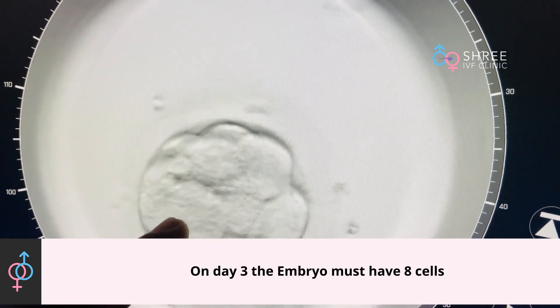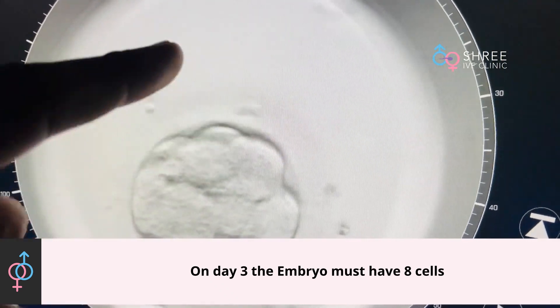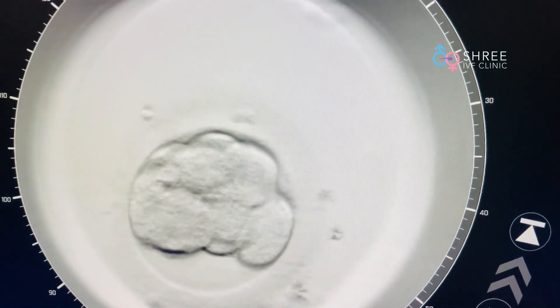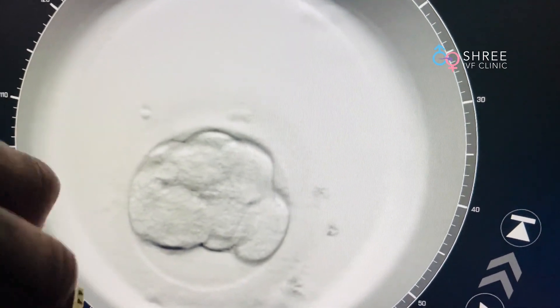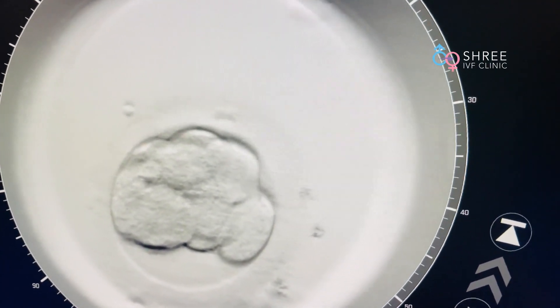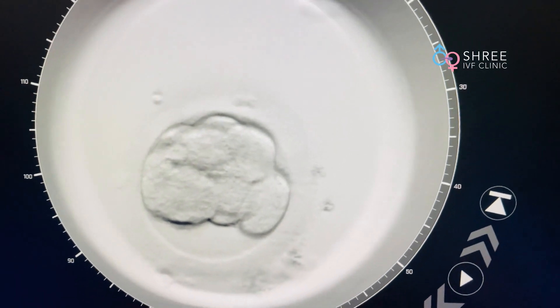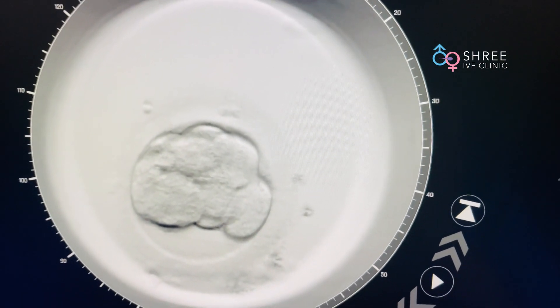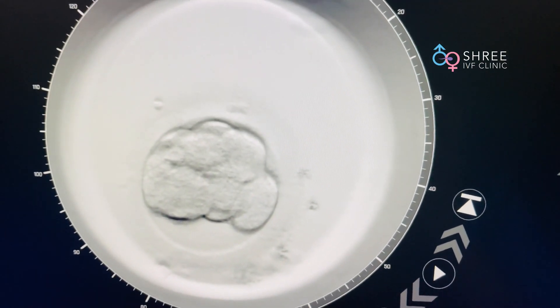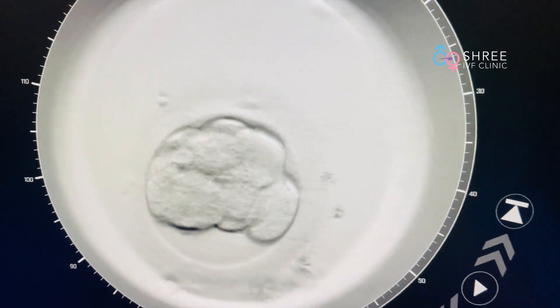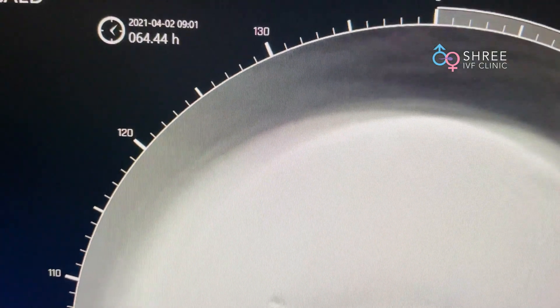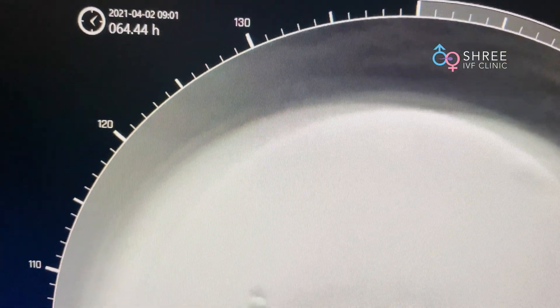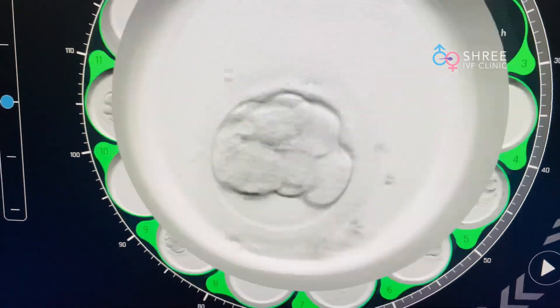Here you can count: 1, 2, 3, 4, 5, 6, 7, and then there is one more cell in the back. Maybe an experienced eye can see that. So this is an embryo which has grown to 8 cells at the desired timeline — at around 64 hours. This is very good for us.